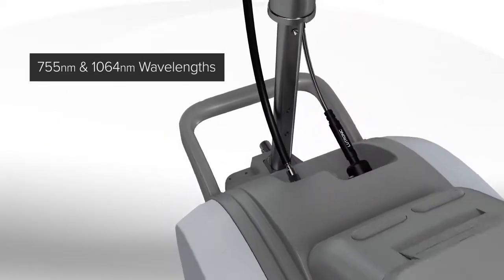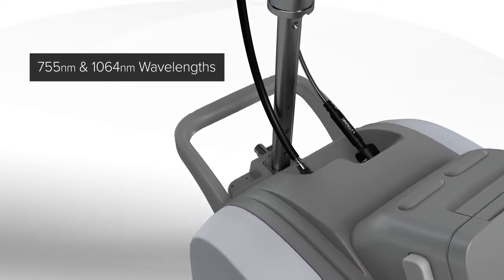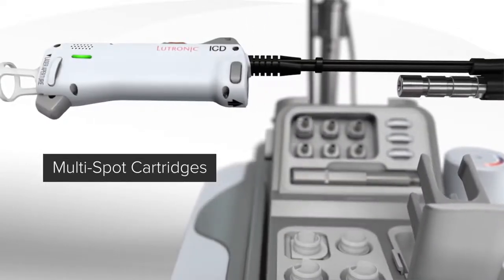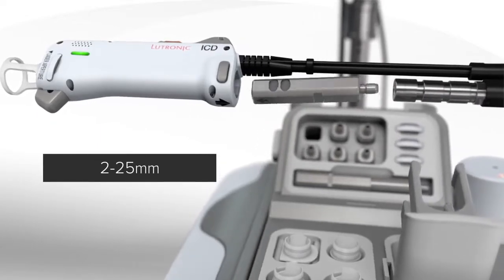Clarity 2's dual wavelength single fiber platform operates at up to 100 joules with easy to change multi-spot cartridges ranging from 2 to 25 millimeters.